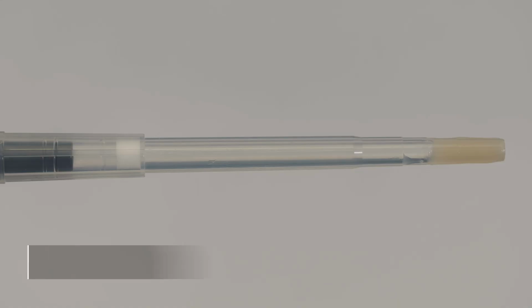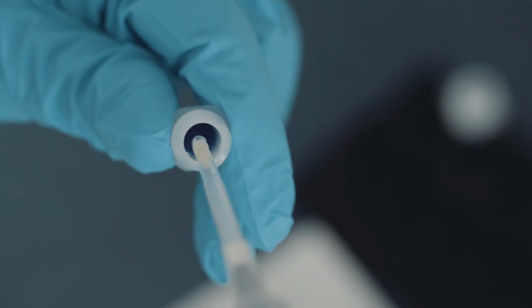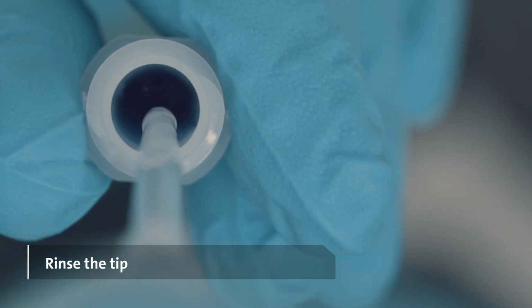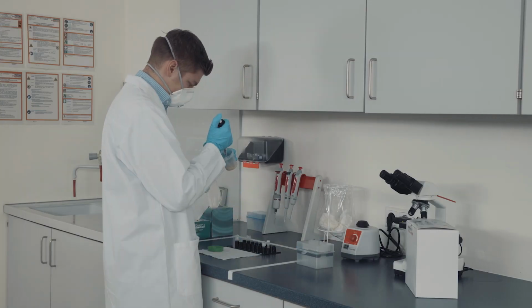Take 60 microliters of the sputum. Depending on the sputum, the acceptance is in between 40 and 80 microliters. Transfer the sample in the respective heating tube. Rinse the pipette tip with the lysis buffer to remove the sputum completely. Repeat this for every sample.